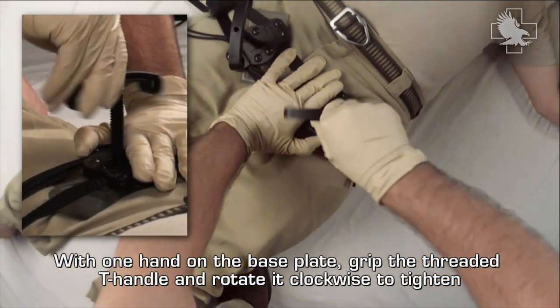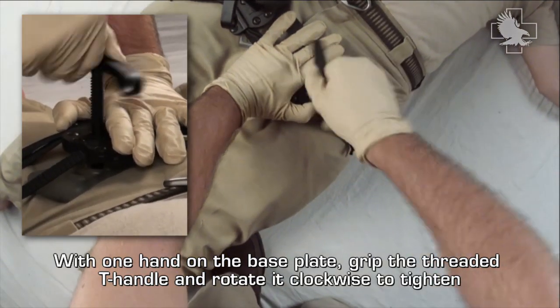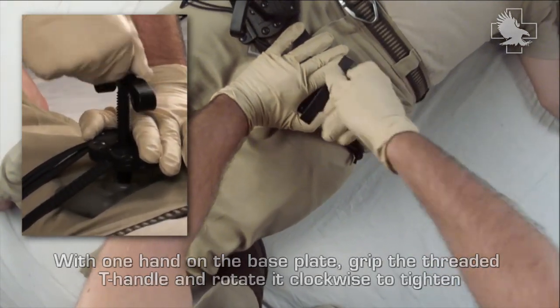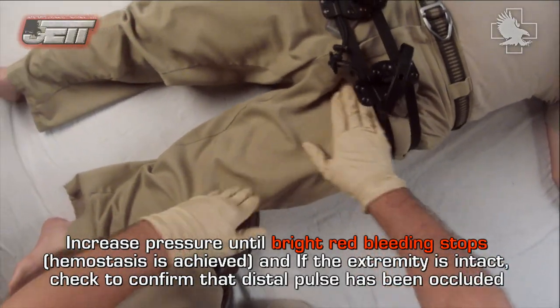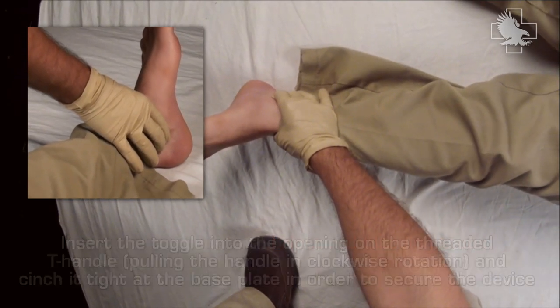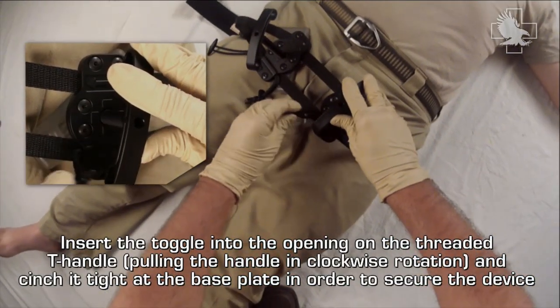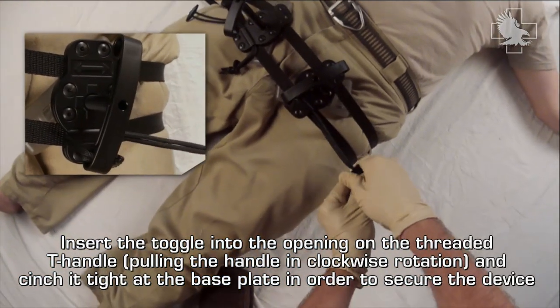With one hand on the base plate, grip the threaded T-handle and rotate it clockwise to tighten. Increase pressure until bright red bleeding stops and hemostasis is achieved. If the extremity is intact, check to confirm that the distal pulse has been occluded. Insert the toggle into the opening on the threaded T-handle and cinch it tight at the base plate in order to secure the device.